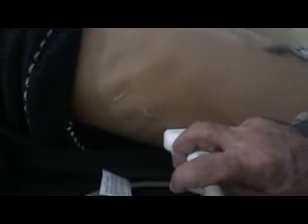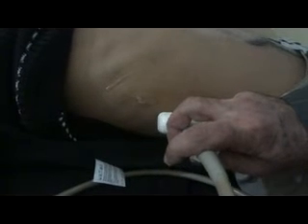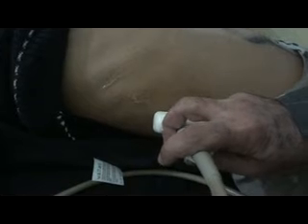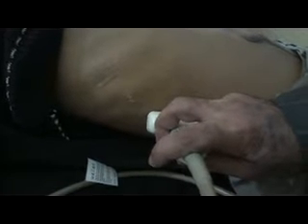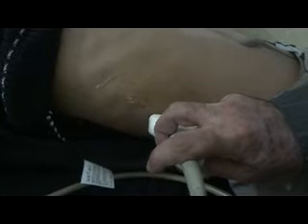In this video we will study the difference between the liver echogenicity and that of the right kidney. The normal is that the echogenicity of the liver should be more than that of the right kidney.